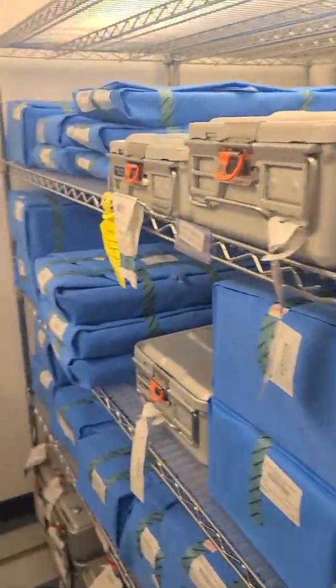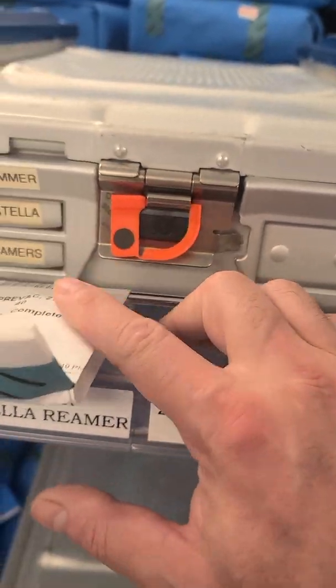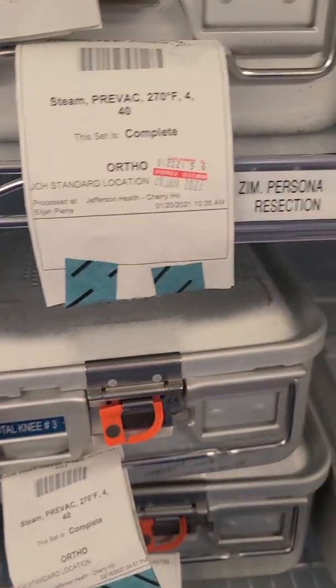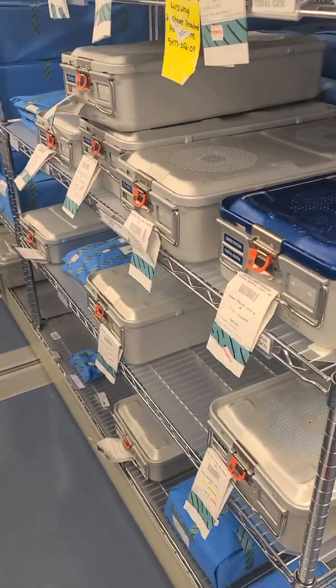Your storage area should not be commingling non-sterile and sterile items. Everything here should be sterile. How do you know? External indicators — Type 1 indicators — change. So all of these items stored here are sterile.